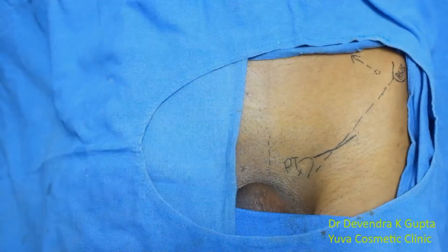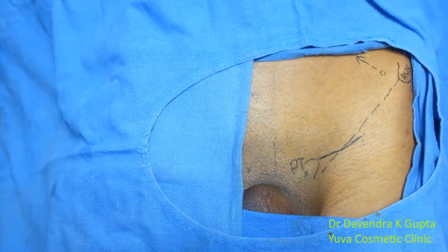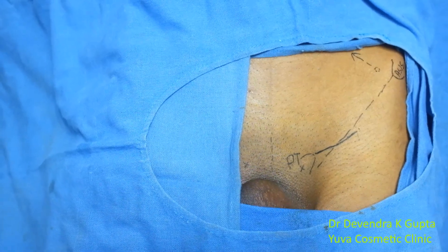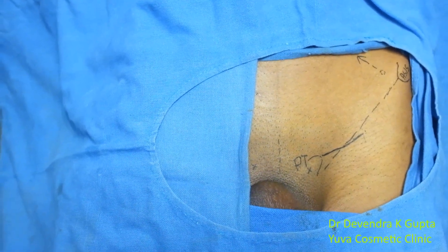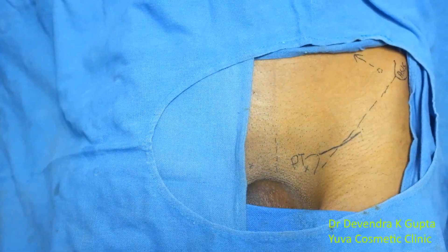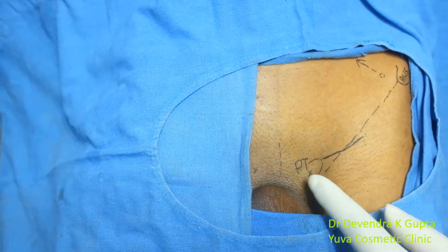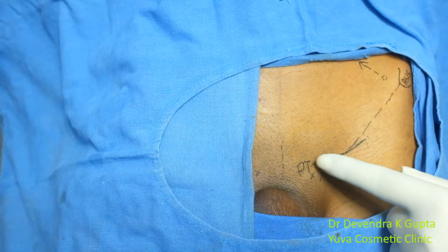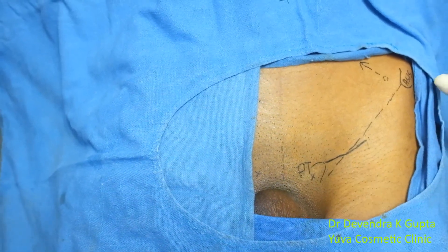This patient is 20 years old and has varicocele on the left side. I am planning to operate under local anesthesia. I have marked the pubic tubercle, and this represents the external inguinal ring.